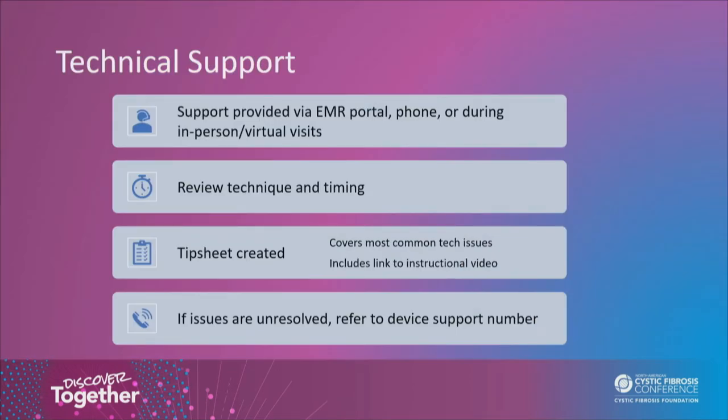It quickly became apparent that technical support would be necessary, as Greg noted. That support is provided via the patient portal, by phone, in person, or during virtual visits. We discuss what the issues are and work to resolve them. We also review technique and timing.